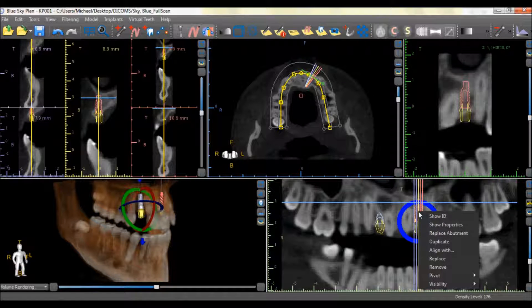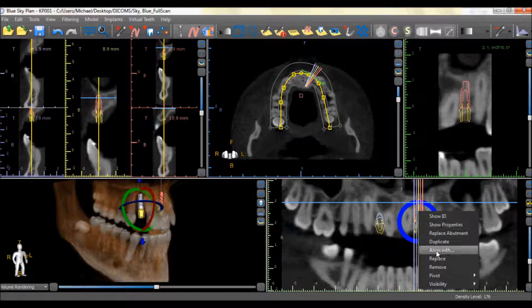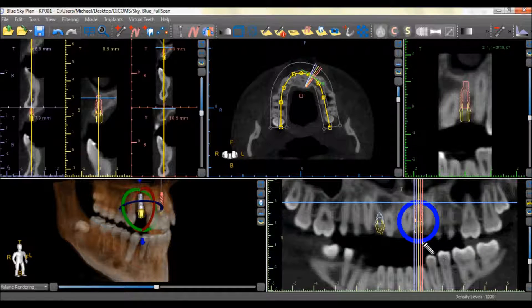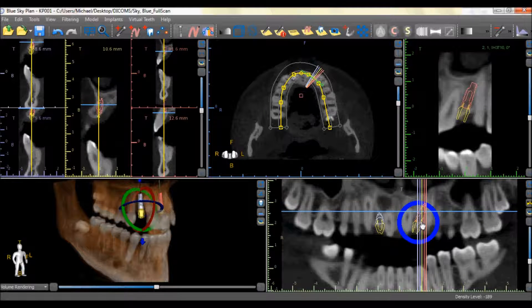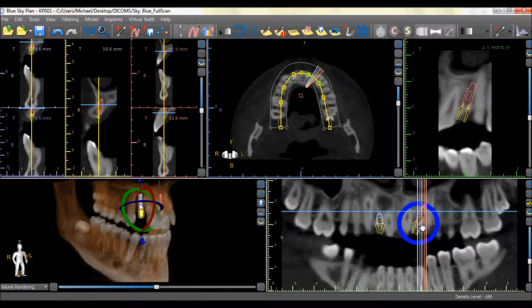Choose the Align With option, then click on the original implant. The new implant will now be aligned at the same angle as the original implant.